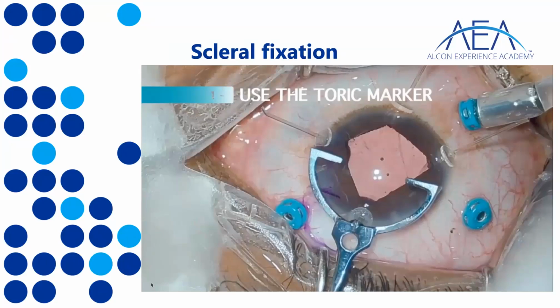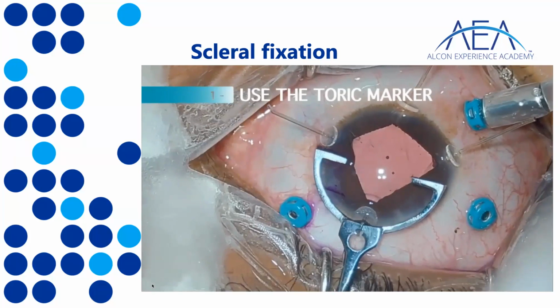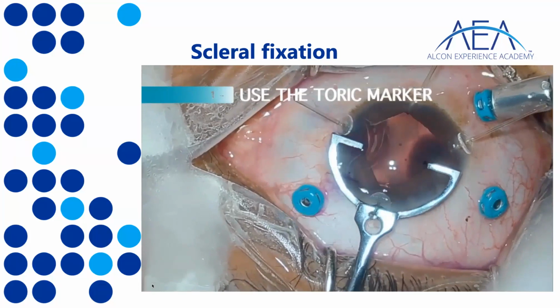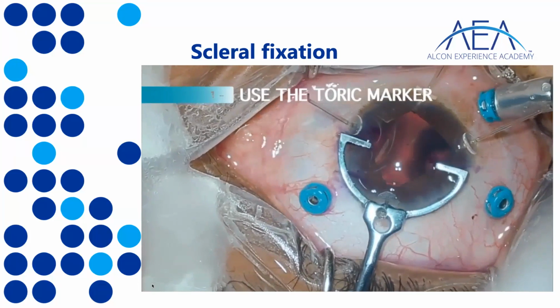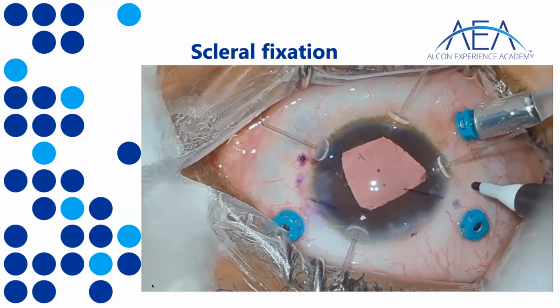So this video starts using a toric marker. This is useful, of course, to have a reference 180 degrees apart. I would suggest a VR surgeon is probably best to do this kind of procedure because a vitrectomy is usually necessary.